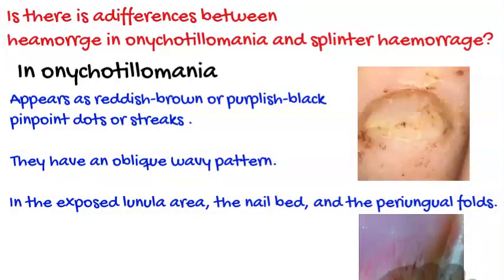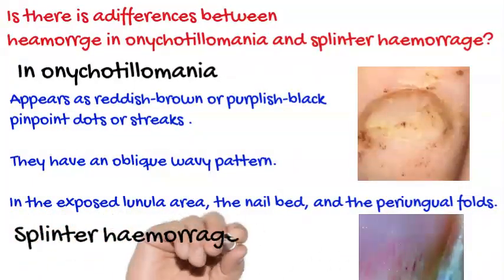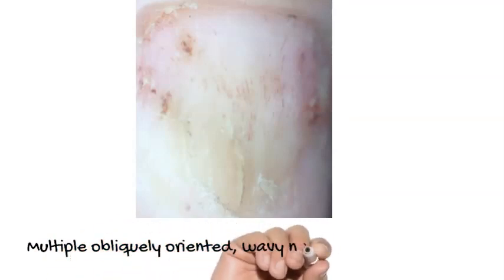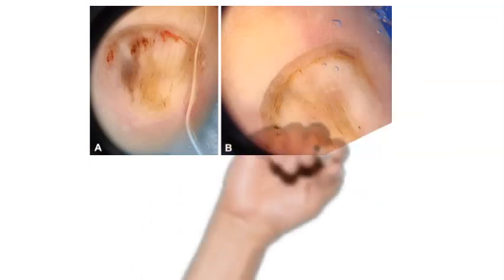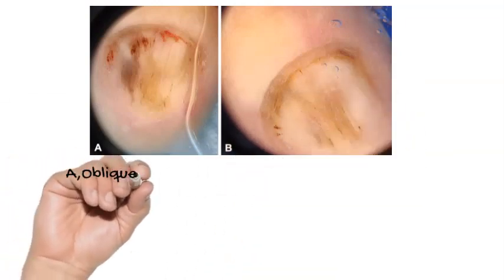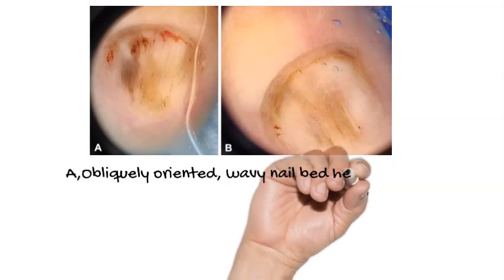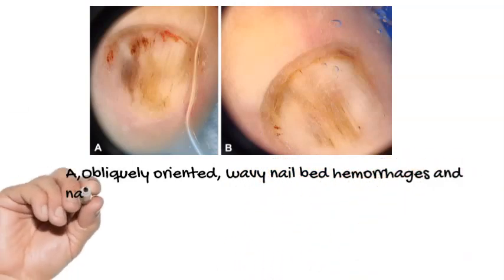While in splinter hemorrhage, it is longitudinally oriented. In onychotillomania, hemorrhages are multiple, obliquely oriented wavy nail bed hemorrhages. Note the wavy lines — this nail shows obliquely oriented wavy nail bed hemorrhages and nail bed pigmentation associated with wavy lines.